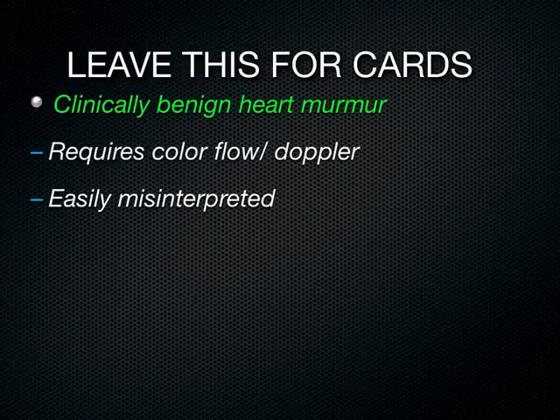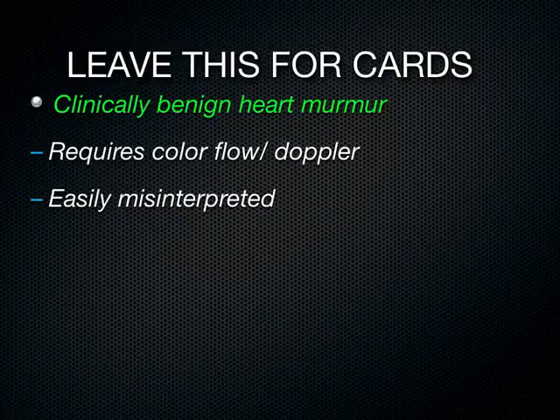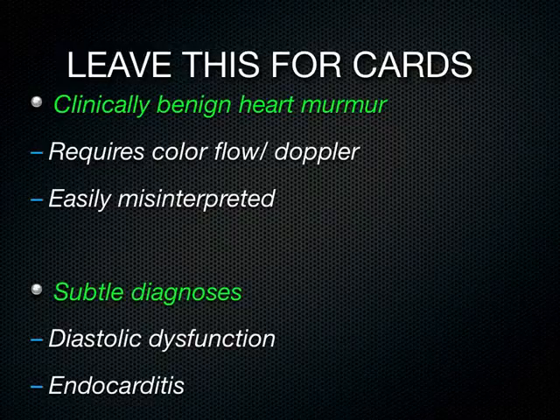But stuff we're going to leave to cardiologists, you know, stuff with the heart murmur. You come out of the room and go, hey, the patient's got a heart murmur, want to go look at it? Yeah, I'm sort of curious, as any doctor would be, to see what the murmur looks like. But really, to differentiate how much TR, MR, 1+, 2+, those things have no clinical bearing for me as an emergency physician, and it's easy to misinterpret those color flows across the valves. Other things like early diastolic dysfunction and endocarditis, I've hallucinated hundreds of times now. Just stay away from that stuff unless it's super obvious.